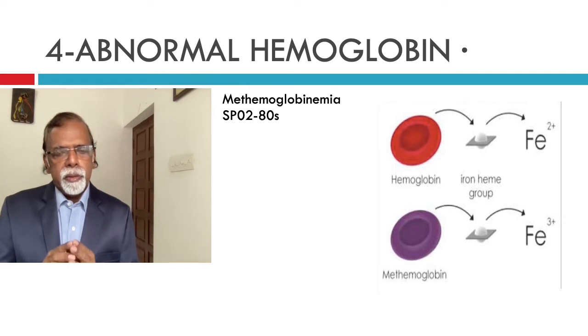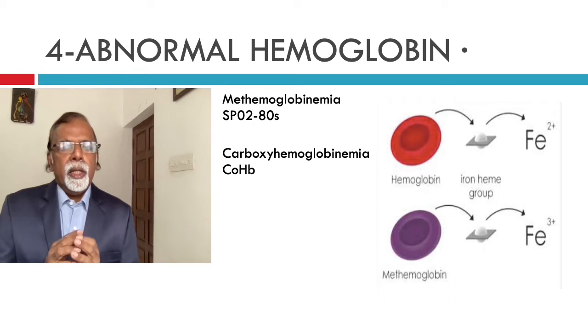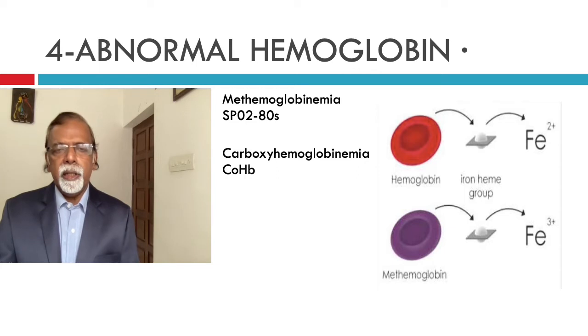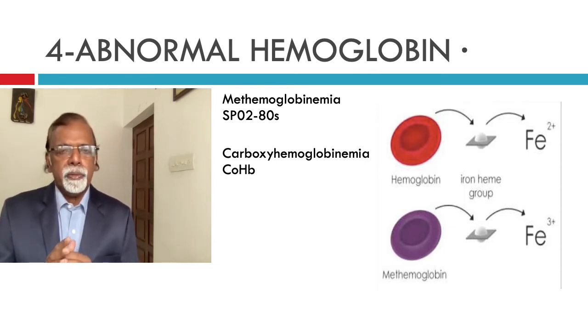As I have already told, in pulse oximetry, only the amounts of oxy and deoxyhemoglobin are measured, or in the calculation of SpO2, only these two hemoglobins are taken into consideration. And so in patients with methemoglobinemia, which can be either congenital or acquired, we can get a false SpO2.